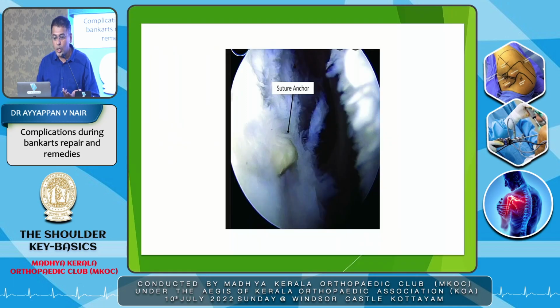Otherwise, we can have the coconut scraper effect where the cartilage goes off. So better avoid any kind of hardware.